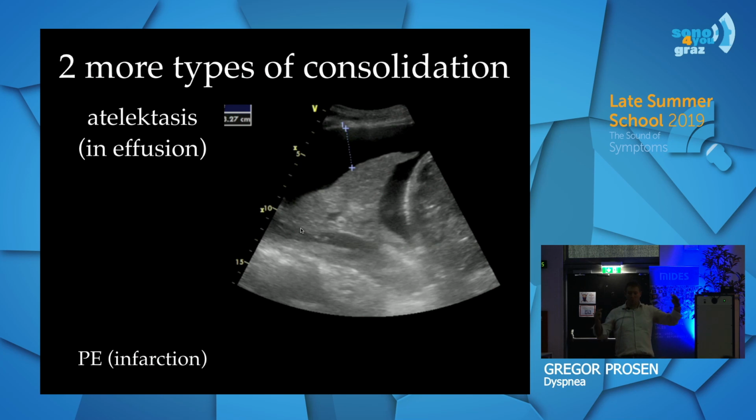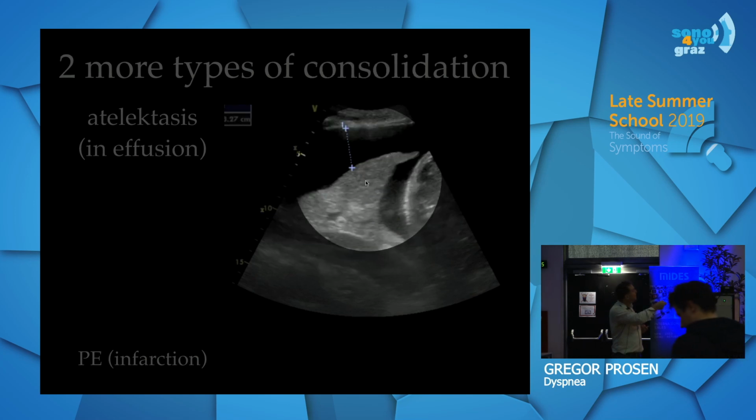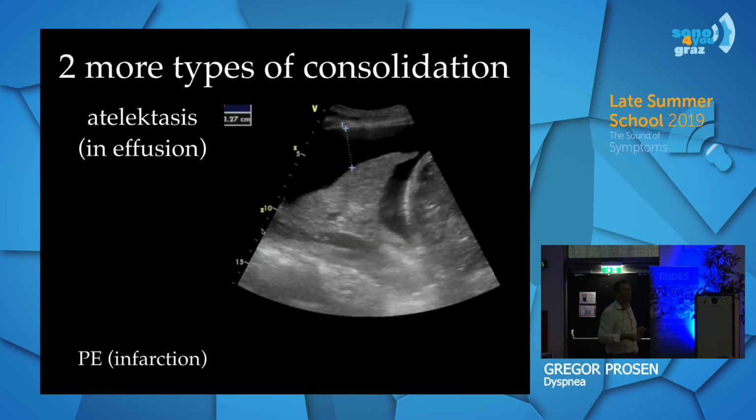And the ultimate proof that all these organs are nicely packed, vacuum packed like peanuts, they're packed in. So if something arises, water arises, then something else has to be squeezed out. And that's atelectasis. And because ultrasound travels perfectly through water and through consolidated lung, ultrasound could show us descending thoracic aorta. How cool is that? Except it's not cool that the lady had a whole left lung full of water.